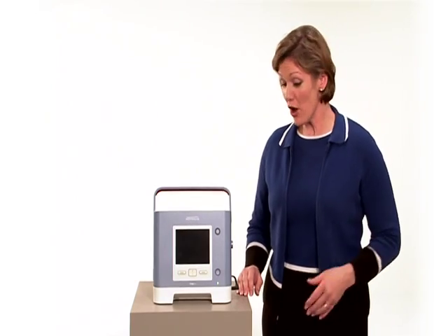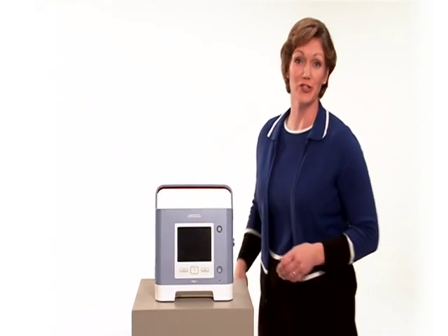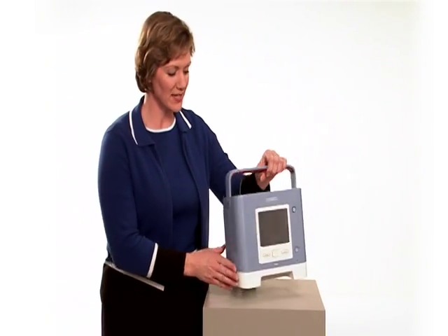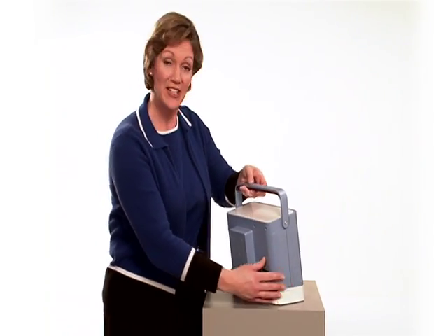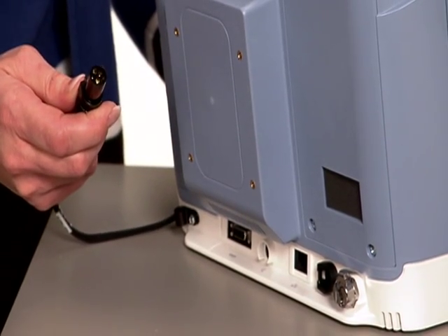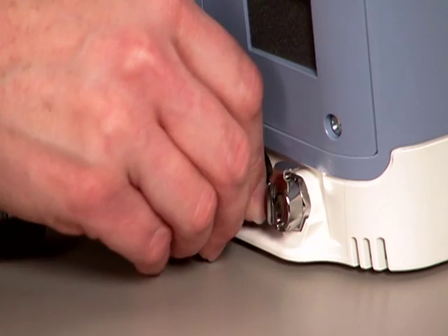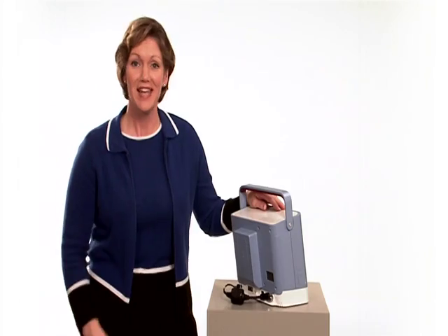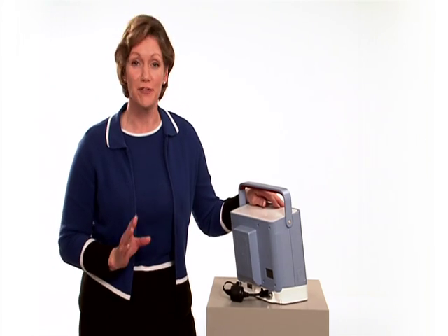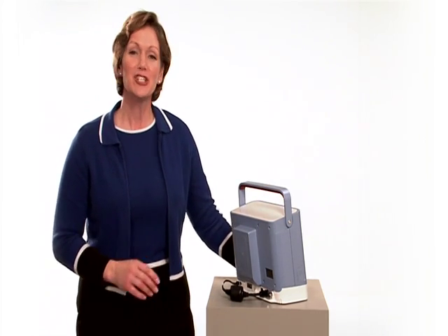The ventilator can also be powered by an external 12-volt marine-type battery. One end of the Respironics DC battery cable is attached to the battery. Plug the other end into the external battery connector power inlet on the back of Trilogy. How long the battery will last depends on the battery and your device settings and usage.